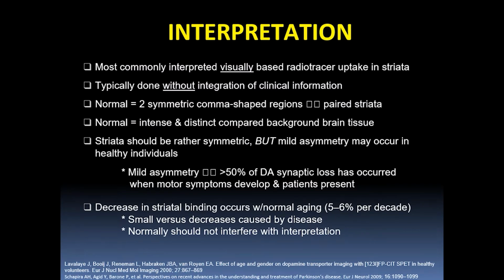So, interpretation. The good thing, in my opinion, is that it's most commonly visually based, so you do not need to have a quantitative or semi-quantitative software package. Ideally, experts advise for the image assessment to be done without integration of the clinical information. You kind of want to read it cold. You do not want the clinical history to bias you.